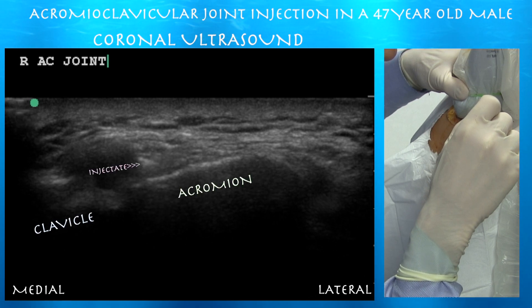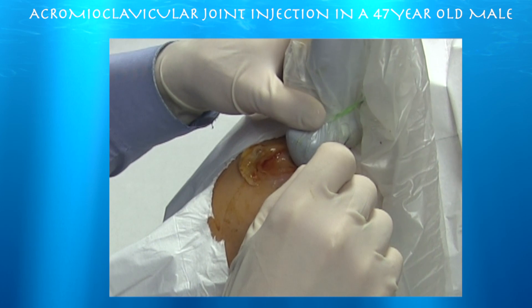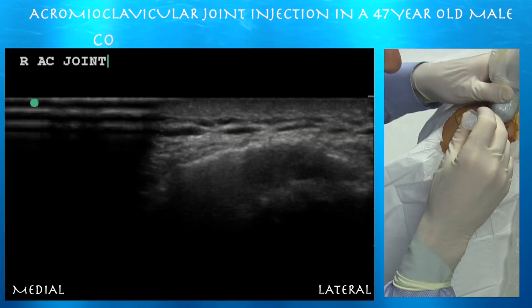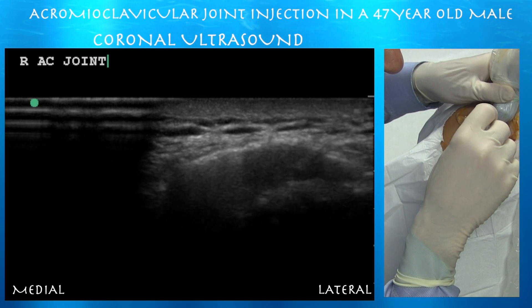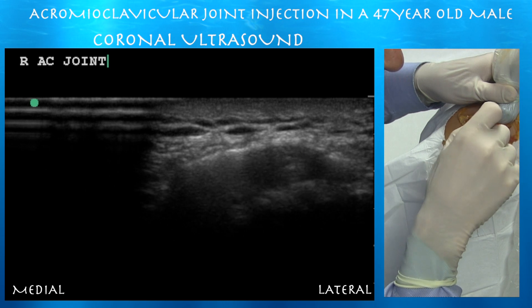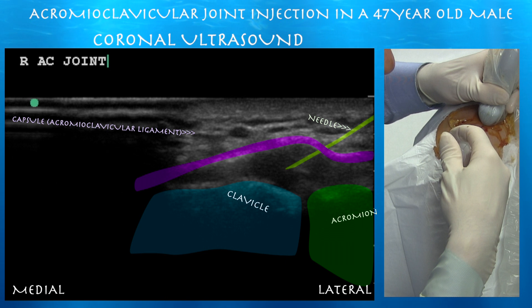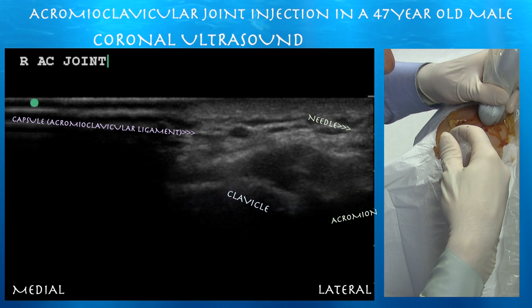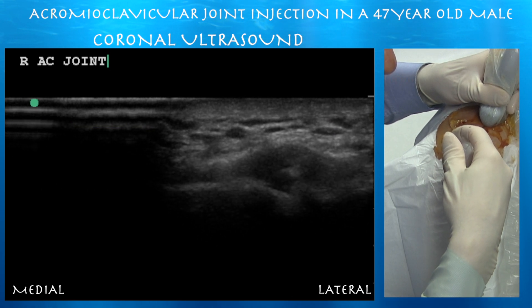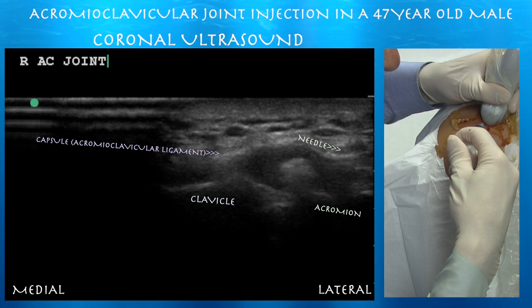Here we are continuing with the procedure. We also decided to do an in-plane approach, rotating the probe and the syringe a little bit in order to do an in-plane approach with a long-axis view. Here we have a long-axis view and we can see the tip of the needle going underneath the capsule above the acromioclavicular articulation. You don't want to squeeze it between the bones, as there is a disc there which you don't want to damage. As long as you're underneath that capsule, you're going to inject the acromioclavicular joint. Here you can see the injectate, which is that bright flash, and eventually that will seep down into the acromioclavicular articulation.